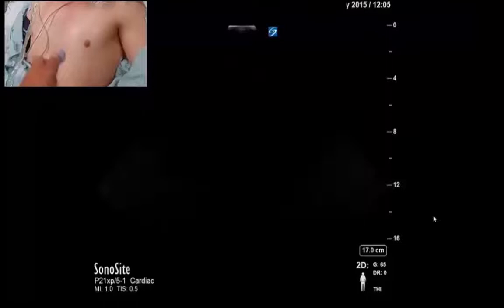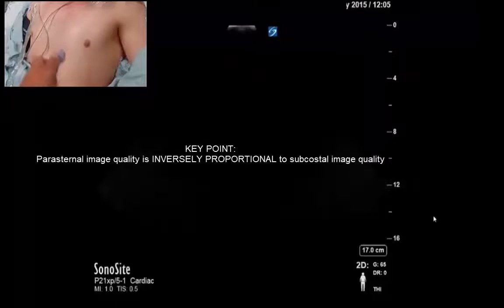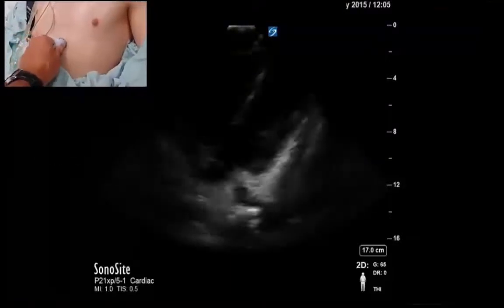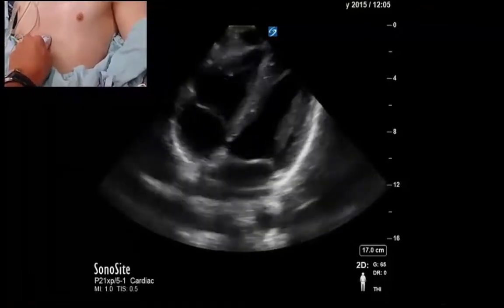When you find patients who have no parasternal windows, there is often an appropriate shift of the heart down caudally, and that's why they have no parasternal windows. What that typically means is they have a decent or even excellent subcostal window. Let's see what the subcostal space looks like and see how we can maximize the views we can get from it.